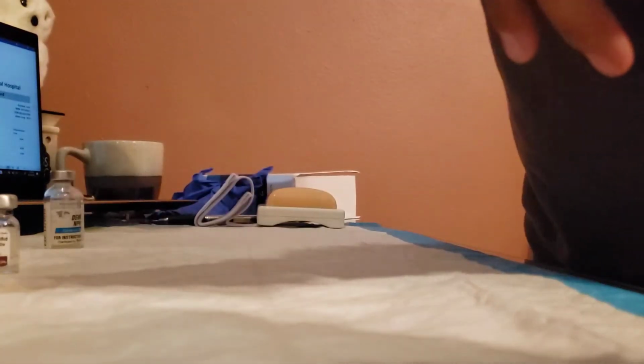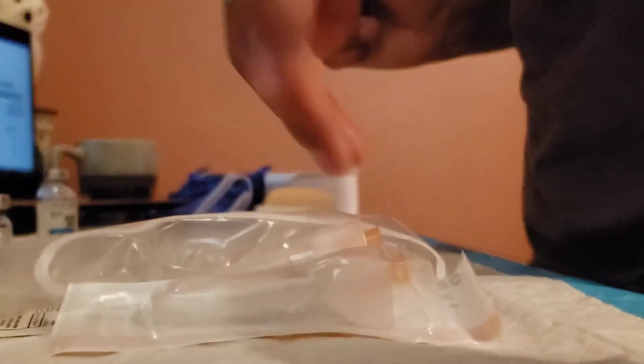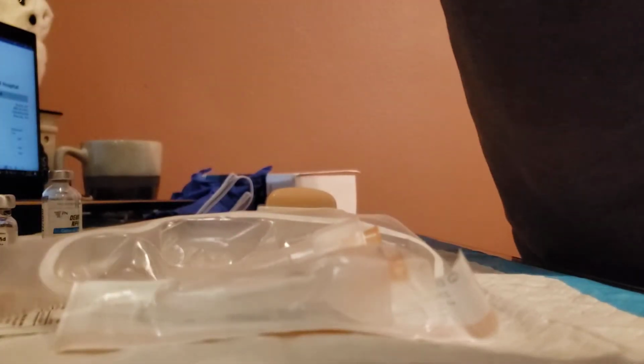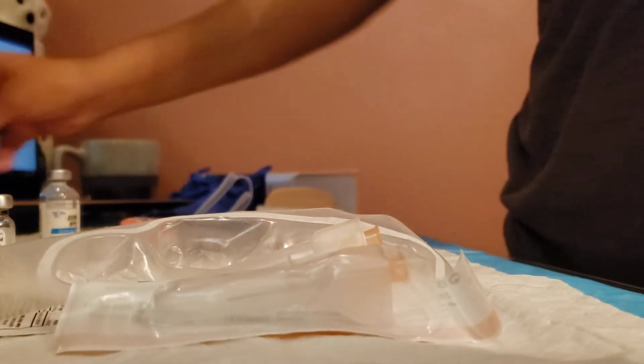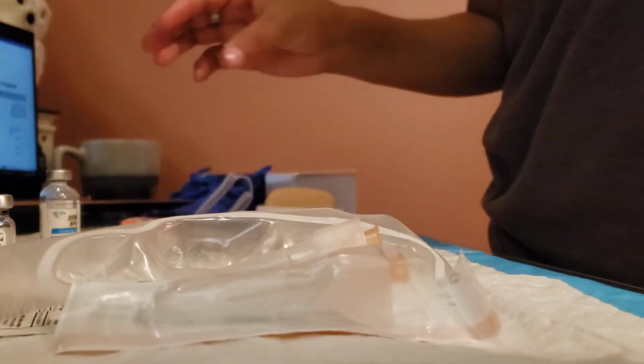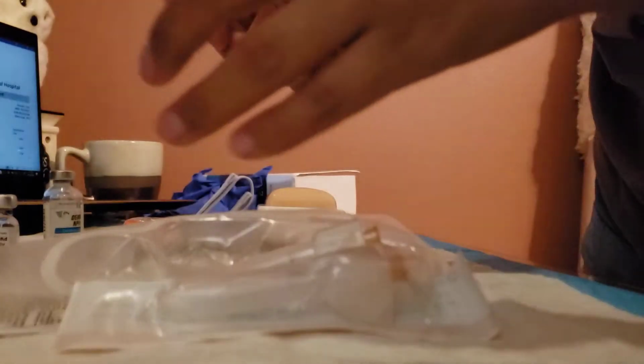So I'm going to grab my supplies now. I need my alcohol pads for my vials, and I need my 3 ml syringe and 2 needles for my antibiotic, one to draw and one to use on the patient. I need my TB needle and my insulin needle. I'm going to want to begin with the antibiotic here, so I can go ahead and reconstitute that.